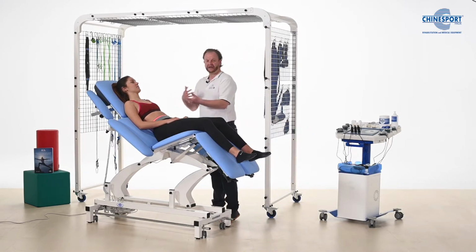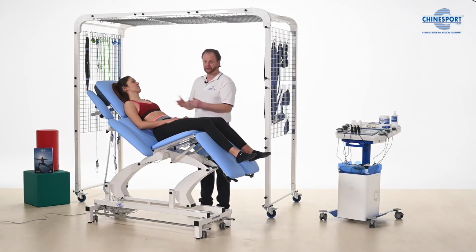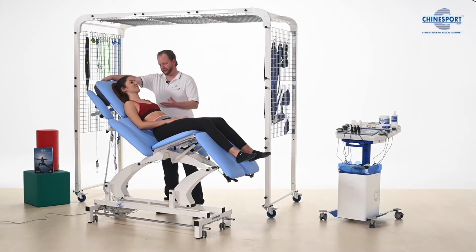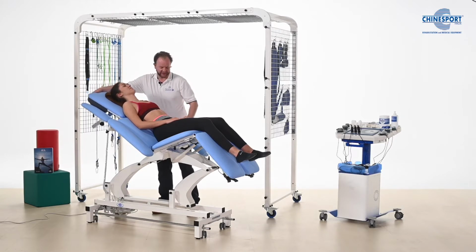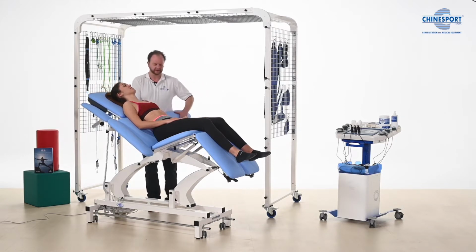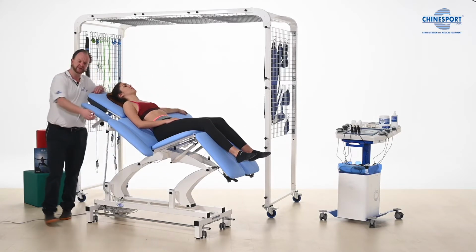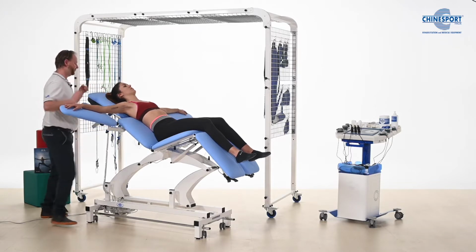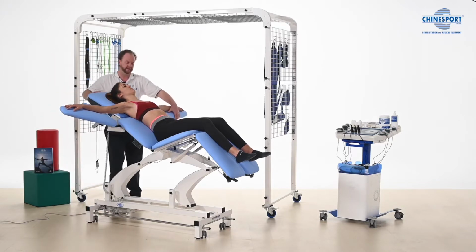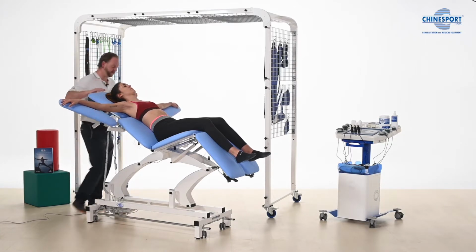And here we have eye-to-eye contact. We're at the same level, so we can use this opportunity to inform the patient and to relax the patient. We're not going to explain to you what you have right now, but at this point in time it's fine that we take this opportunity just to maybe teach some of the abdominal breathing. And like this we can start focusing on stretching the intercostal muscles and the pectoral muscles.